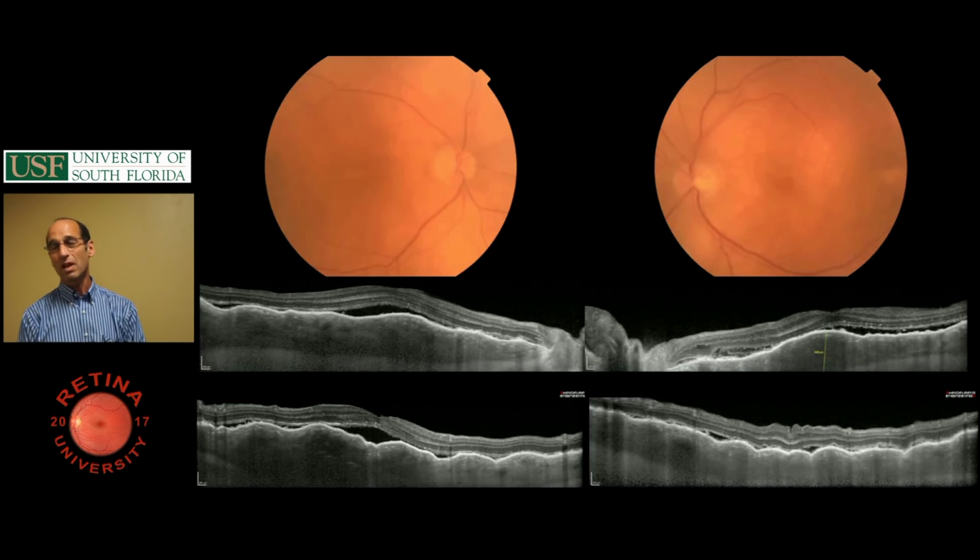And the other thing is I'm trying to get his cataracts out so I can get better pictures. It could be uveal effusion, but again, there's not a lot on choroidal OCTs that I've seen. I'd love to see a review article on the choroid and OCT, because I think if you had a good review, this would not be uveal effusion, because it looks infiltrated. It doesn't look so much fluidy. But it could be the undulations are uveal effusion. And it does look kind of like uveal effusion.